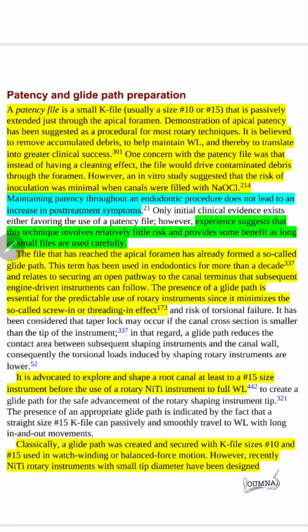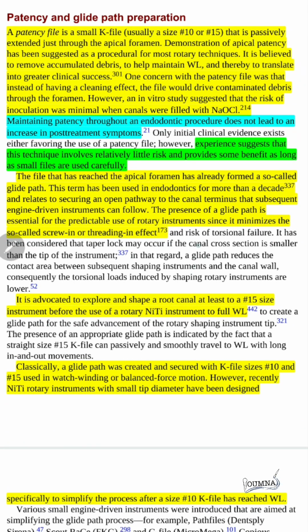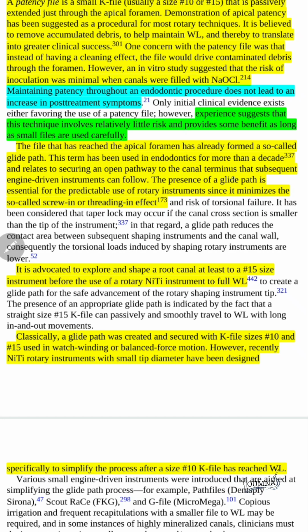Some concern was highlighted that patency may be driving contaminated debris through the foramen, and it may cause post-treatment symptoms, but studies showed that this effect is minimal on the result, and this procedure did not lead to an increase in post-treatment pain. So it is advisable to do the patency to ensure that the full length of the canal is accessible.